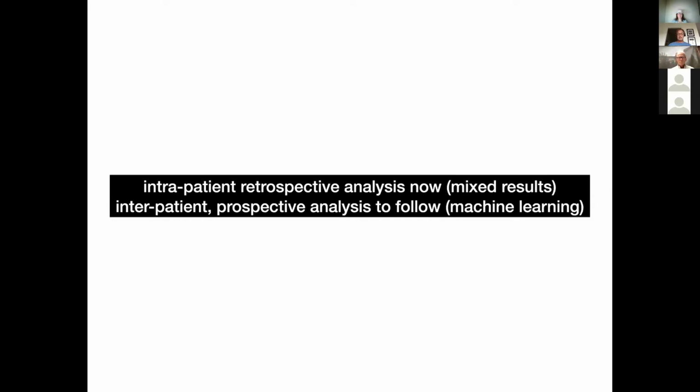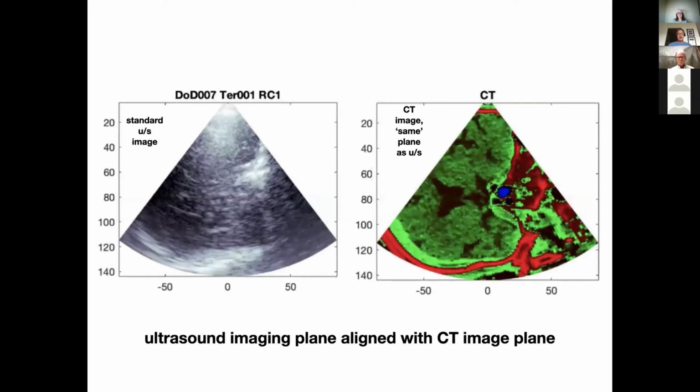Briefly, the data set we have on your left is an ultrasound image, temporal window to the top of this baseball field-like shape, skull along the bottom, and some vague shapes in the middle. This is standard diagnostic ultrasound. Through a lot of work, we align a slice in the patient's CT image with that diagnostic ultrasound. So red is skull, of course. This lime green in this case is a subdural bleed, I believe. There are the ventricles, brain tissue.